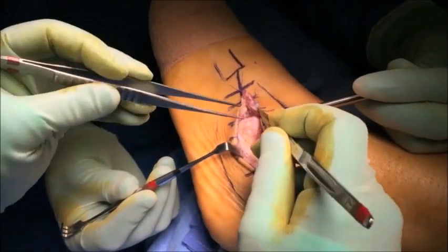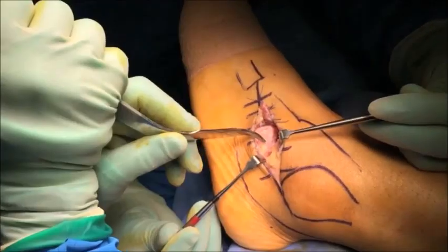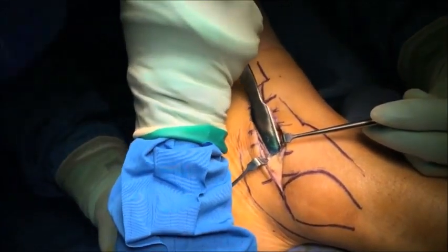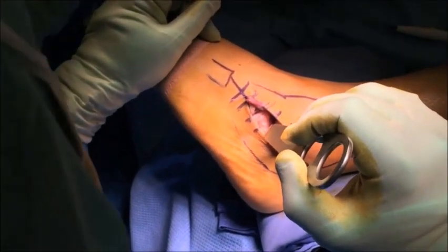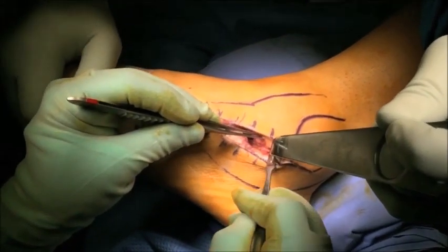The peroneal tendons are then identified in the proximal aspect of the incision. It's very important to do this carefully as it's very easy to cut these tendons. Once the peroneal tendons have been identified, a sharp Hohmann retractor is inserted medial to the peroneal tendons as well as the CFL ligament, going around the posterior aspect of the subtalar joint. The capsule of the posterior facet is then incised, exposing the subtalar joint.